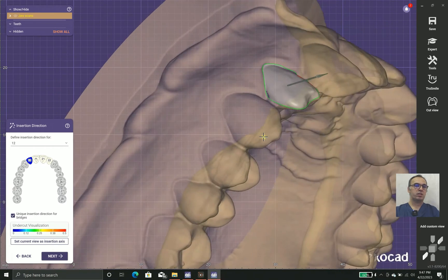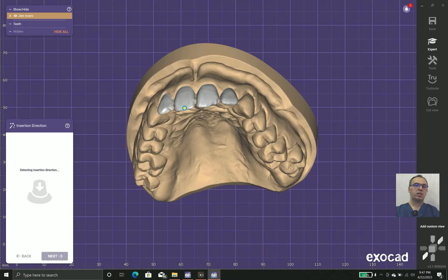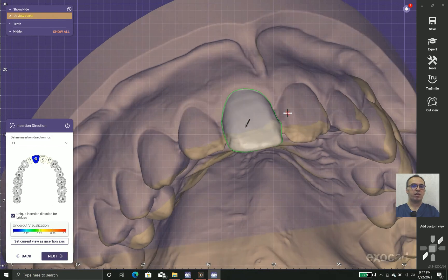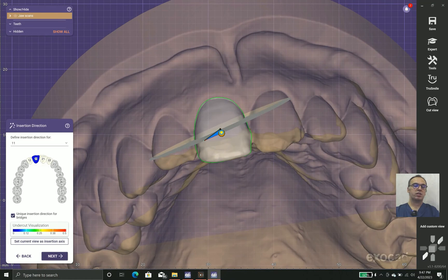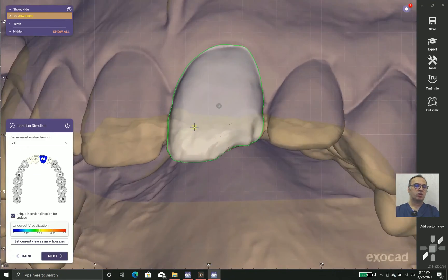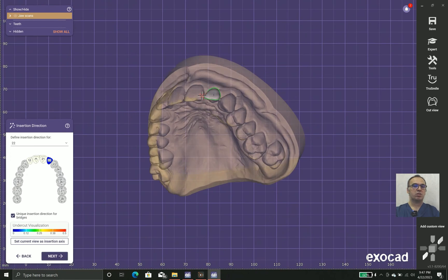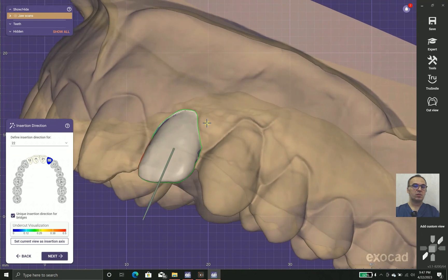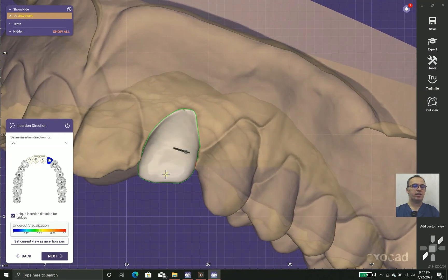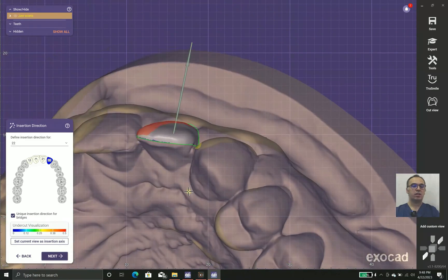Undercuts are dangerous because the software has two scenarios. One is to block out the undercut, leaving a space that you fill with cement or composite. The other is to put the laminate in contact with the teeth, but then you must shave the teeth or adjust the laminate. Neither is ideal. I prefer to shave the teeth slightly, especially at line angles, so I don't encounter undercuts in the mesial and distal.